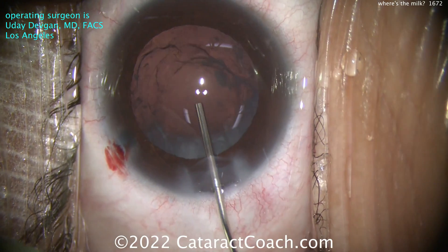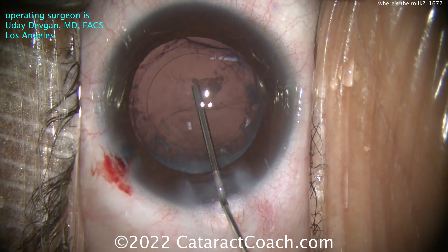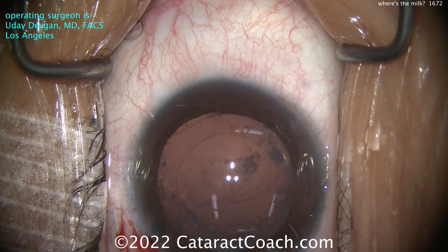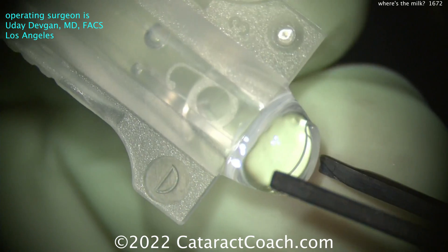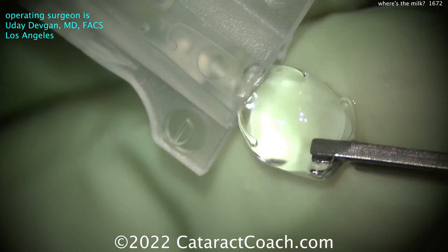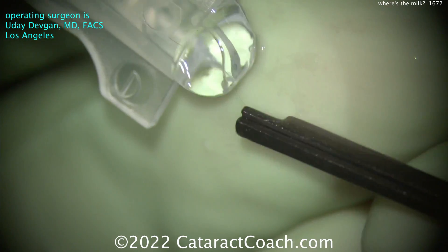There is some sub-incisional material and I think we can get that out. Let's put the lens in first - fill the bag with viscoelastic, and then once the lens is in we can swirl the lens around and loosen up some more of that sub-incisional material. Here's the lens - I'm going to load it up myself, just want to make sure. The tech wanted some help here so I'll do it for the technician.